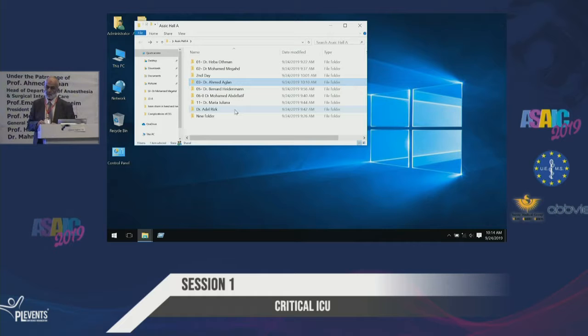Some ventilators, especially out of the auto mode, the mandatory one, they are requesting during volume control, like Mindray, and I think Drager also, to set up the flow rate, whether the patient is awake and assisted, or whether it's SIMV.